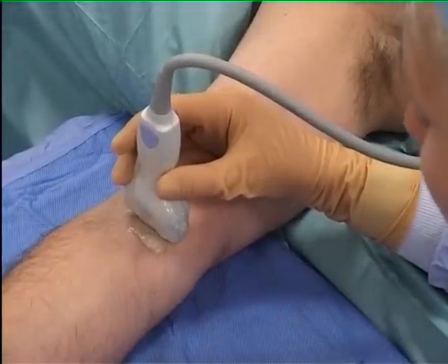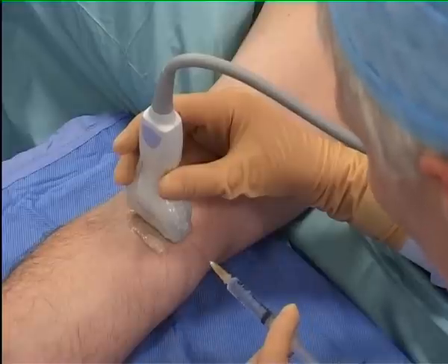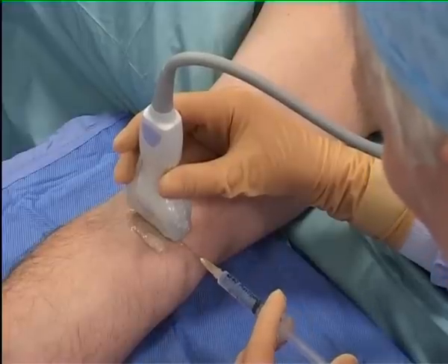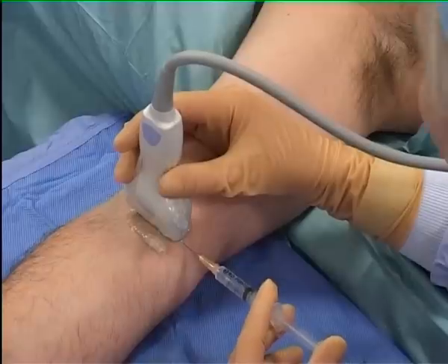Indenting the skin while observing the ultrasound screen confirms correct probe orientation. The scanning hand rests on the patient's arm to maintain a stable image, allowing the puncture site analgesia to be appropriately placed in the midline of the probe.